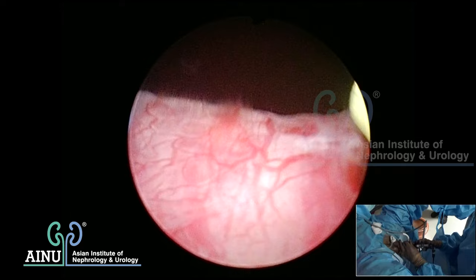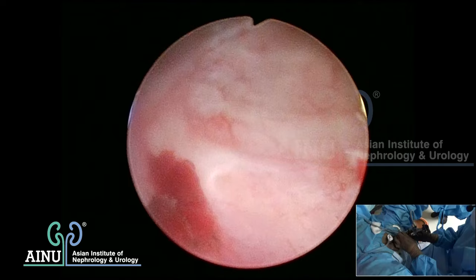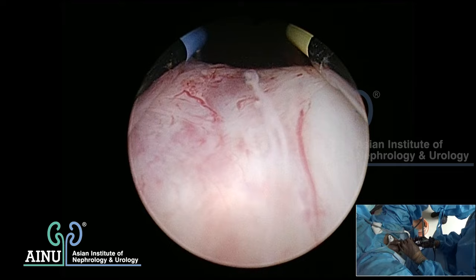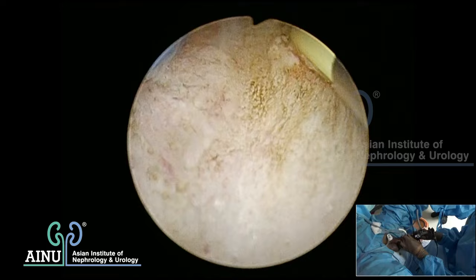Identifying the ureteric orifices - this is the ureter on the left side and this is the ureter on the right side. We are now going to resect the median lobe, starting at the 5 o'clock and 7 o'clock positions, resecting and reaching the bladder neck. You can see the bladder neck muscle fibers.